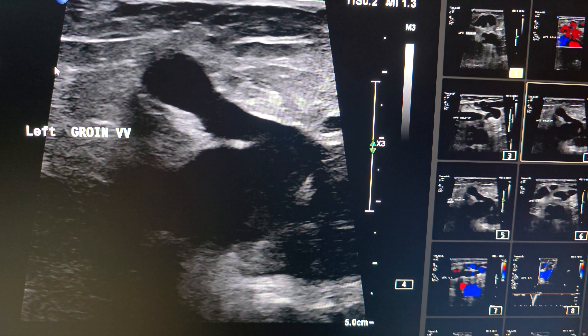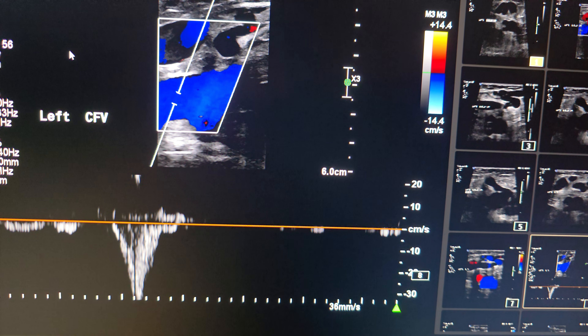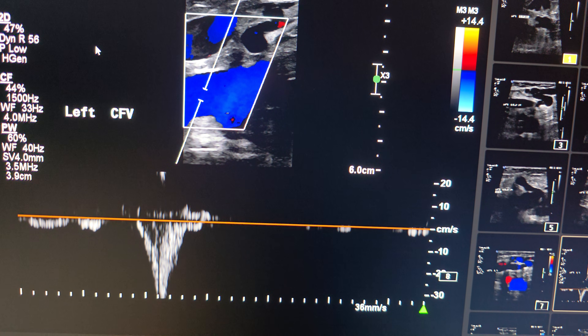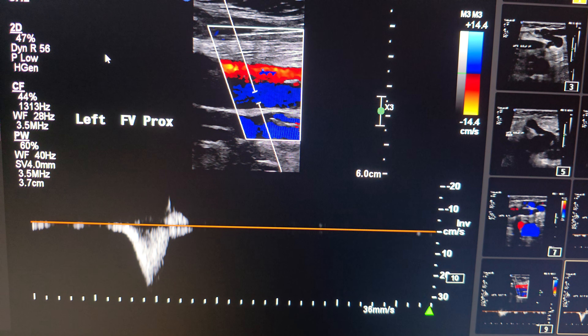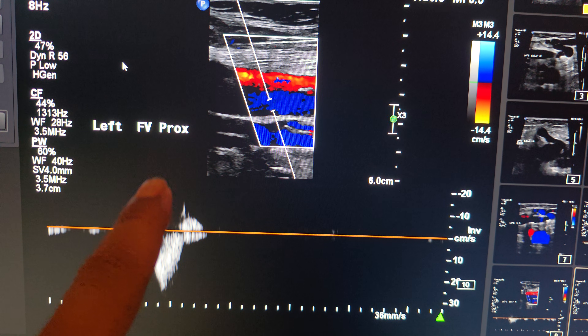We start our protocol as usual by checking the deep system for patency and competence with distal augmentation. The common femoral vein was competent, as were the deep femoral vein and the superficial femoral vein. There is no reflux after the distal augmentation in the femoral vein.